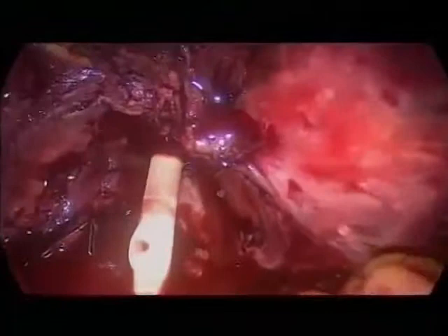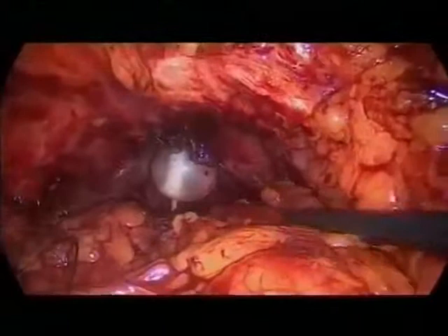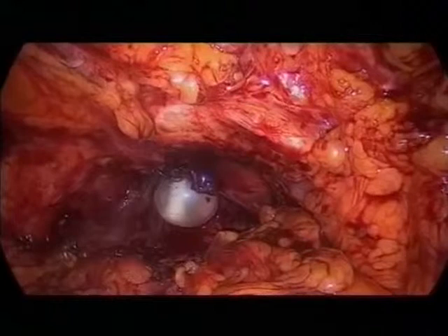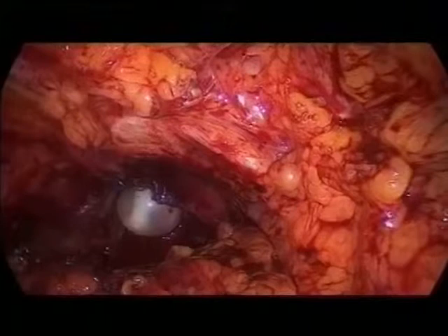So except the PSA of 8, we are in a good oncologic situation in that case to preserve the seminal vesicles. But the tip of a seminal vesicle is rarely involved. Usually it is the base. There are some data showing that if you preserve the tip of the seminal vesicle, you can preserve some nerve, and the result on continence seems better. You have a study made by an Australian team showing a very good anatomic view on the nerve at the tip of the seminal vesicles.